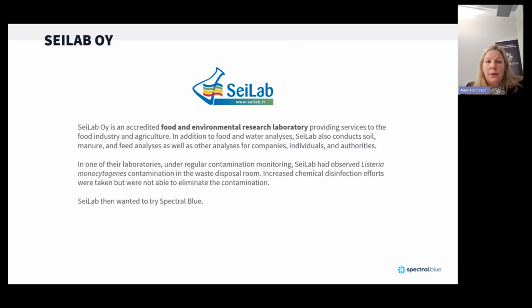There is one more case study, just to come back to Listeria. So Seilab Oy is an accredited food lab here in Finland. They are providing services to the food industry and to agriculture. And they do contamination monitoring in their premises. And in one of these regular contamination monitorings, they observed that they had a Listeria monocytogenes contamination in the waste disposal room.